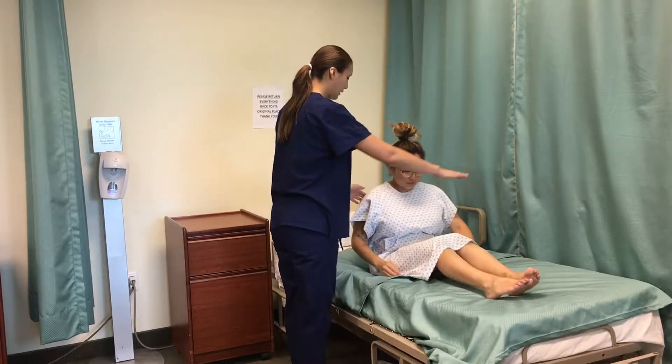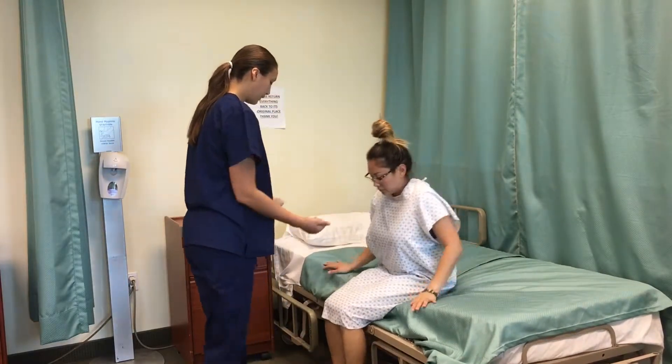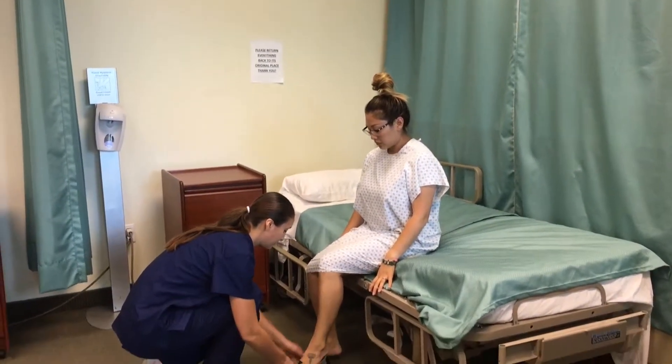Assist client to sit up and have them swing their legs around and scoot until their feet are flat on the floor. Have client put on non-skid shoes before walking to the scale.